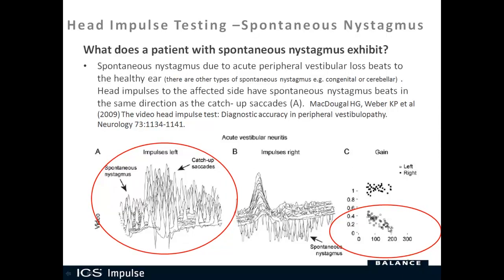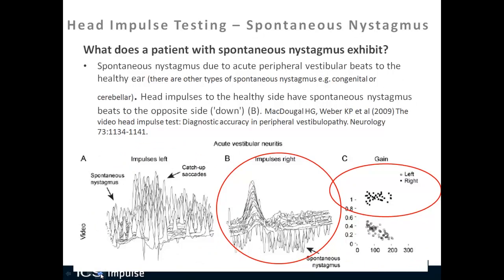When doing head impulses to the healthy side, spontaneous nystagmus beats in the opposite direction from any catch-up saccade. For example, with a right-side head impulse when the right side is normal, there are no catch-up saccades because the right side is normal, but rightward spontaneous nystagmus is present, shown as downward spikes. The right gain is within normal limits; catch-up saccades, if present, would go leftward or upward.